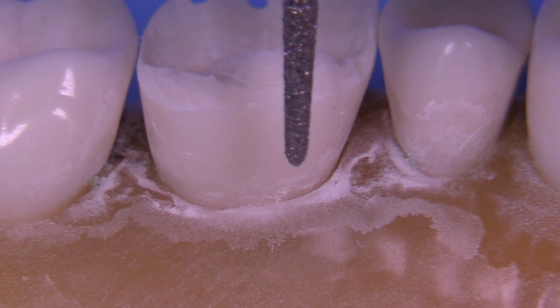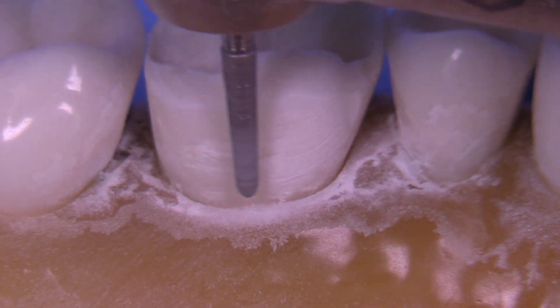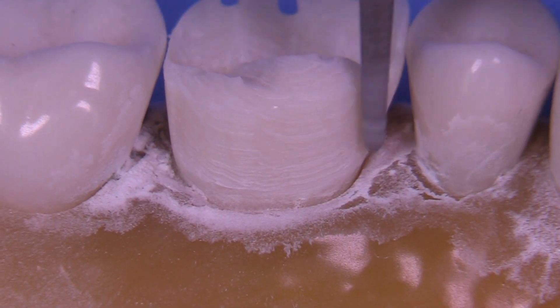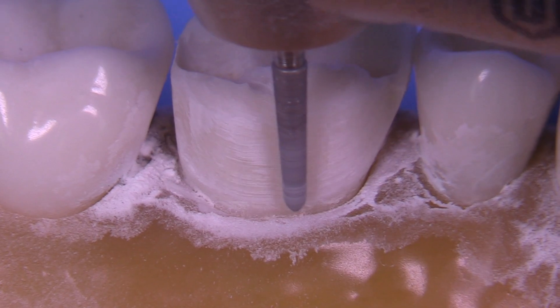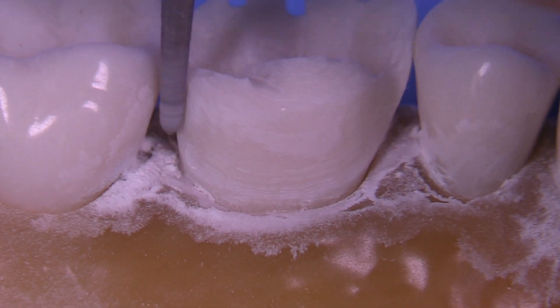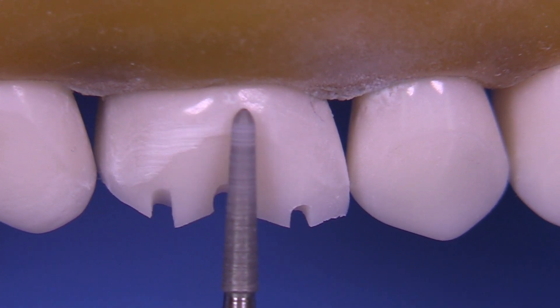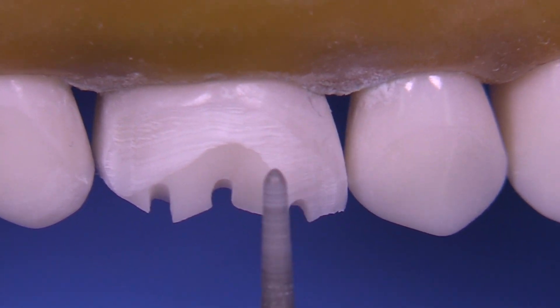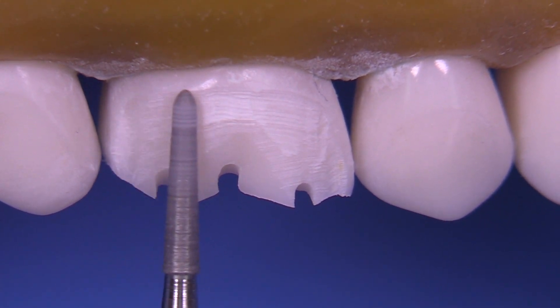When we use this 6878K016 we're following along the long axis of the preparation we're intending to make. This means that the most gingival aspect around the tooth — on the lingual and facial, probably two to three millimeters of axial wall height — should be tapered very nicely at three degrees per side, in other words six degrees of total occlusal convergence. This is a chamfer bur, so it's going to give you a margin or finish line more appropriate for metal and not ceramic. In the case of a PFM with a porcelain butt joint margin on the facial, this bur would not be your final bur.